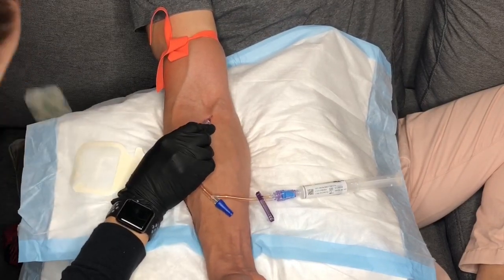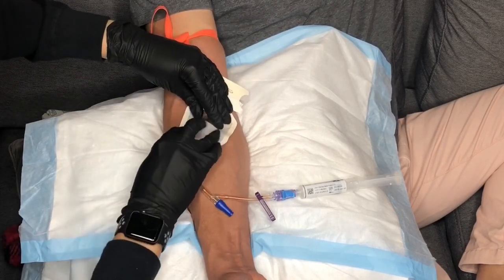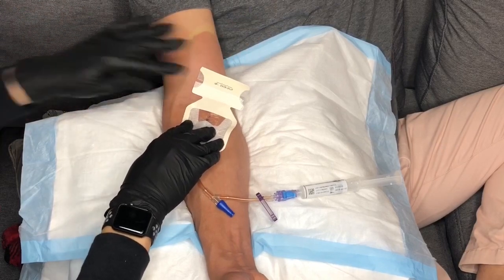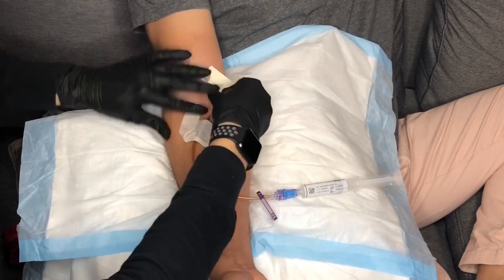If you plan on drawing blood from this newly placed IV, leave the tourniquet on once you have secured the tubing onto the catheter. If you're not drawing blood, remove the tourniquet as soon as you have a free hand to do so.